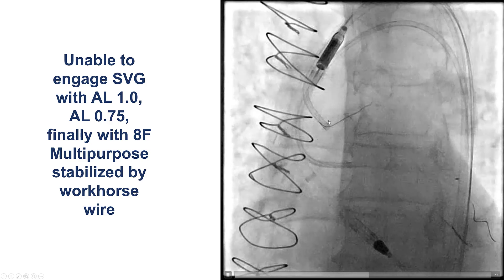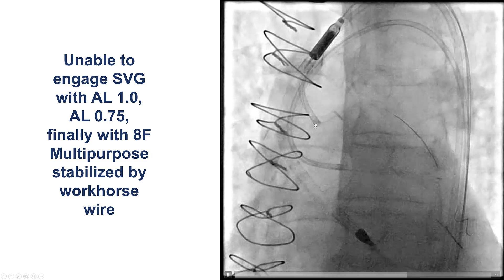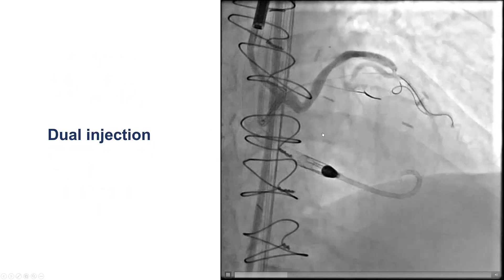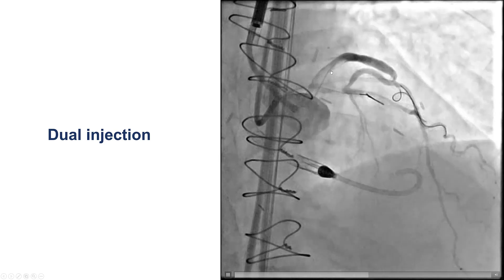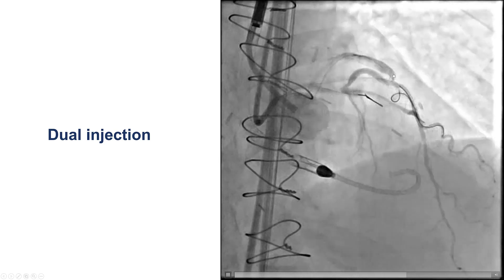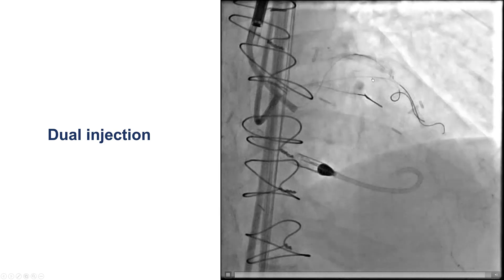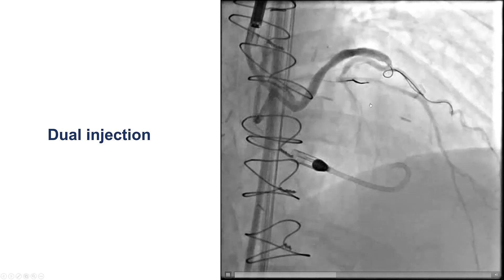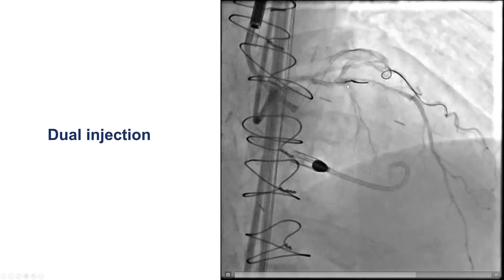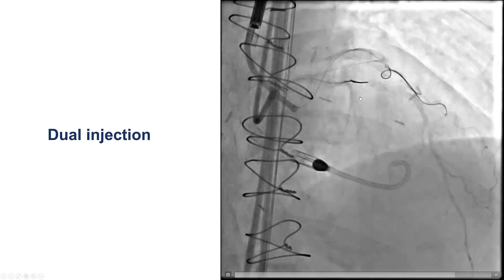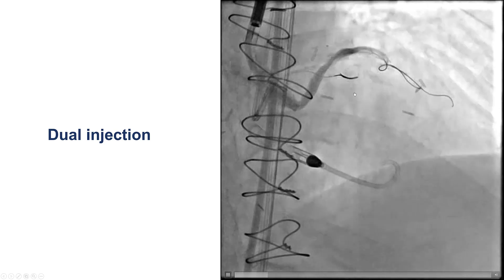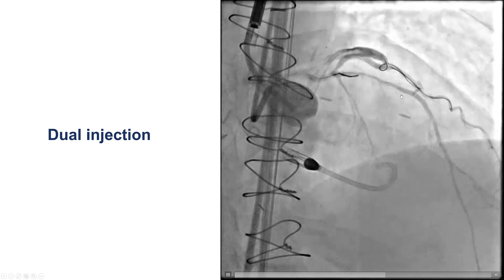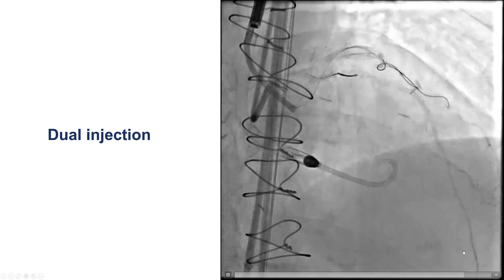Engagement of the SVG to diagonal was challenging but was eventually achieved with a multipurpose guide. This is a dual injection. There is a saphenous vein graft to the diagonal that then fills the LAD, which seems to have a significant lesion at the mid-segment, which is likely the patient's culprit for angina given that the LAD is a very large vessel.